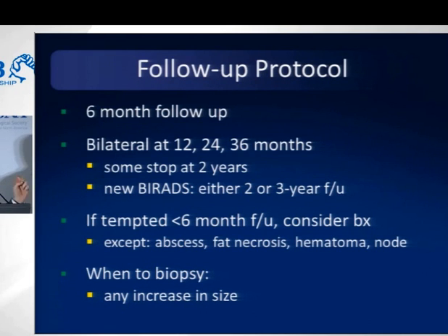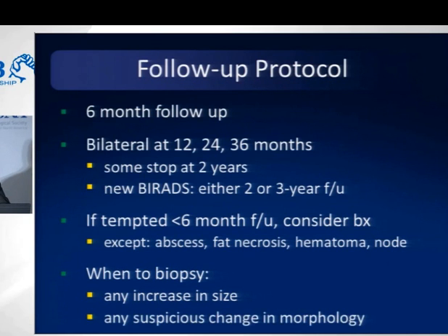If you think that growth is real and not just a difference in measurement technique, if you think there's any real growth, I would urge you to stop following the lesion, no matter how benign it looks at that point, pull the trigger and do a biopsy. And certainly if there's any suspicious change in morphology, so you were following something, it was circumscribed, you bring it back in 6 months or a year later, and now it's more indistinctly marginated, that needs a biopsy as well.